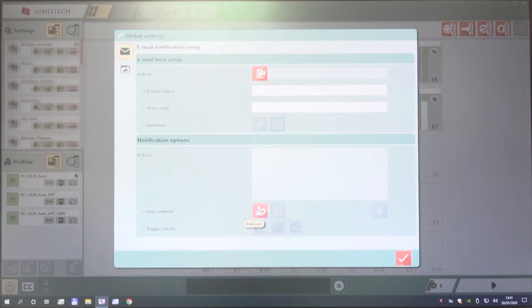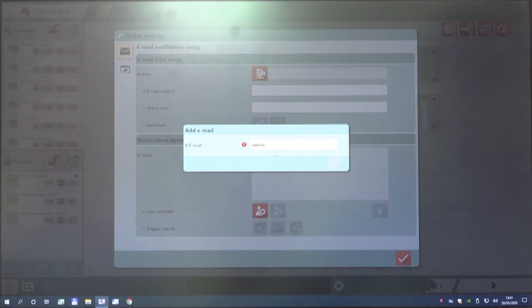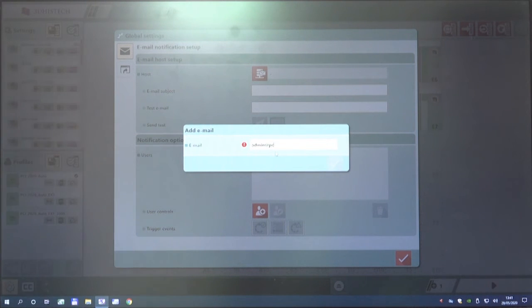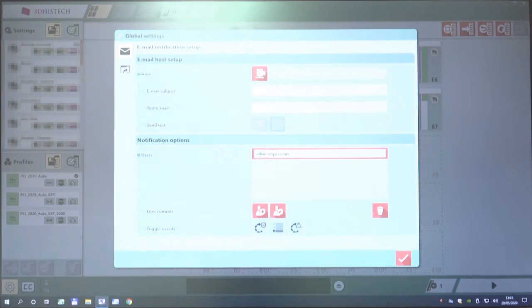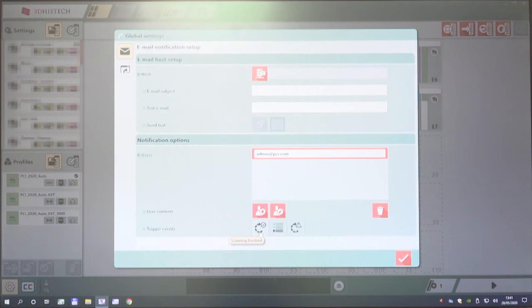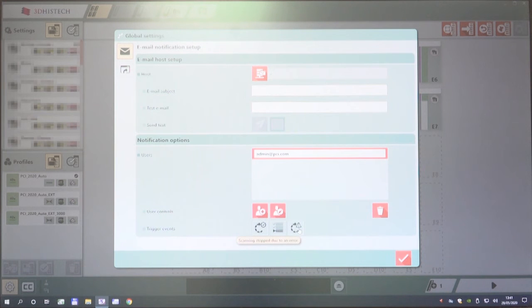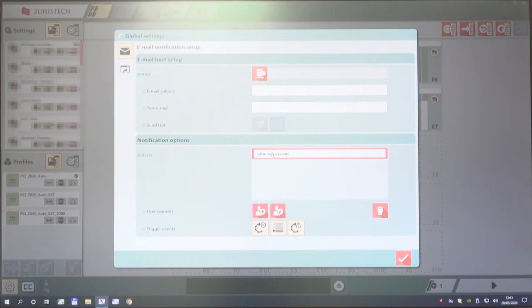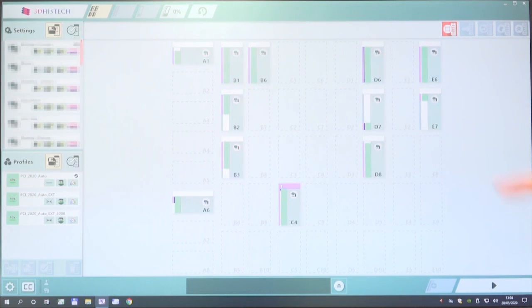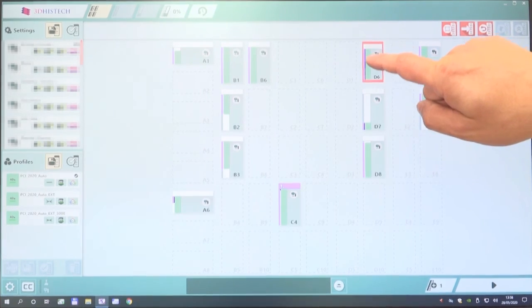We can set up an SMTP server connection, where we can create users with their email addresses, and then send them different trigger events, such as the scanning is finished, or the left magazine is being scanned, or if there's an error. So we can choose which user gets which kind of message.